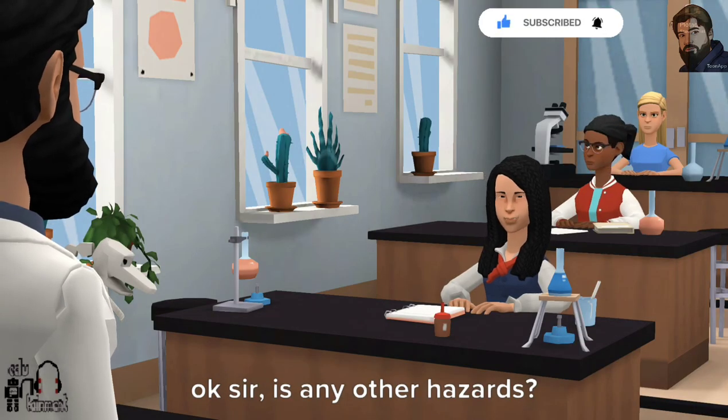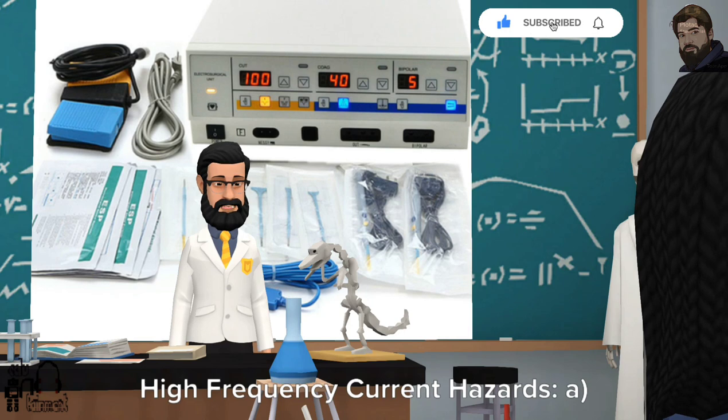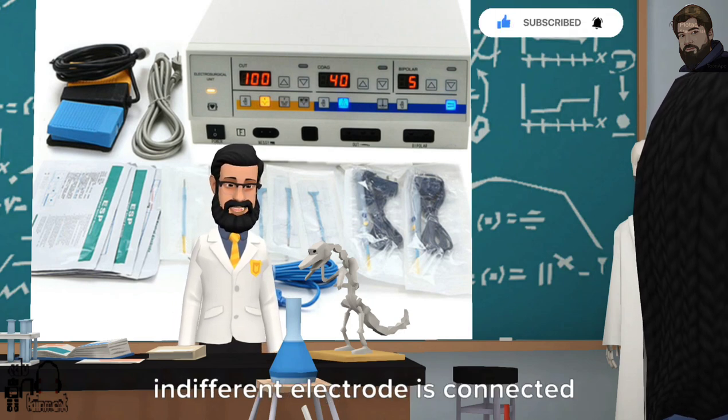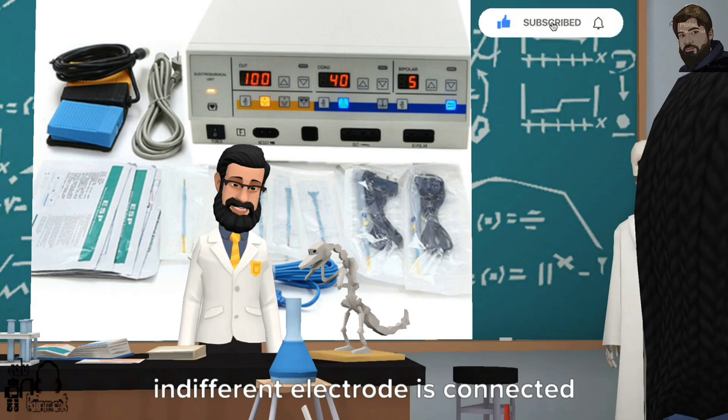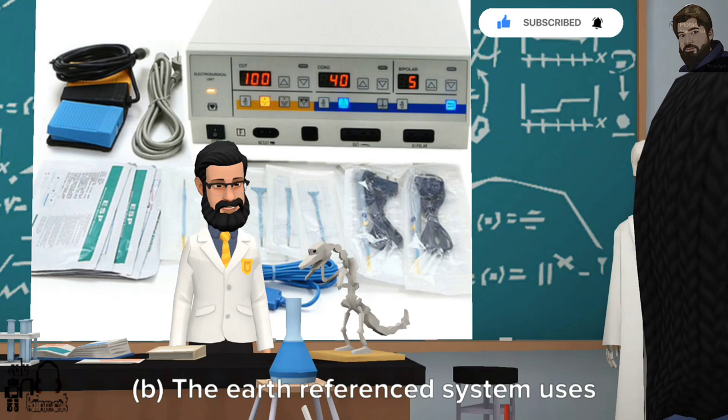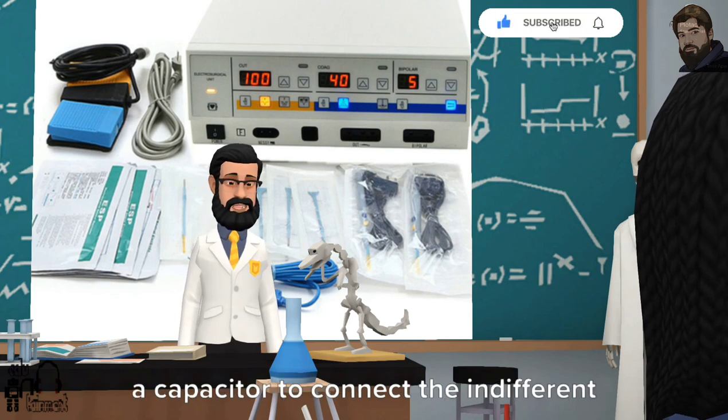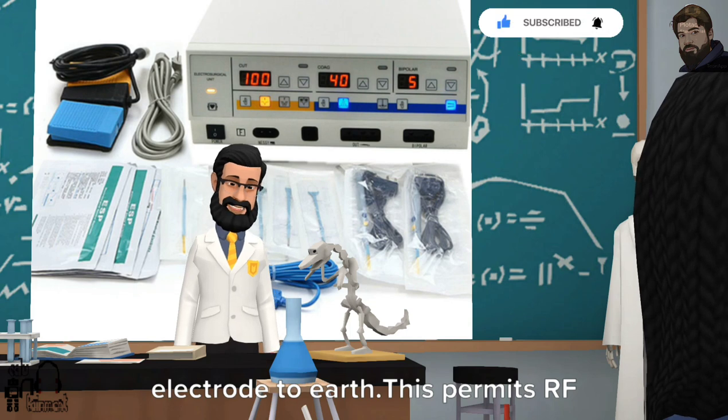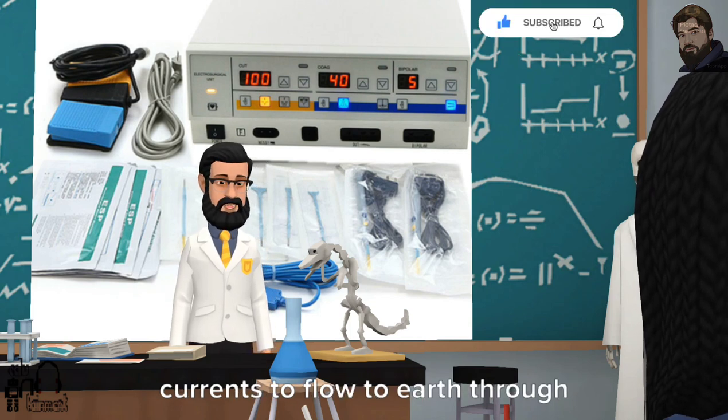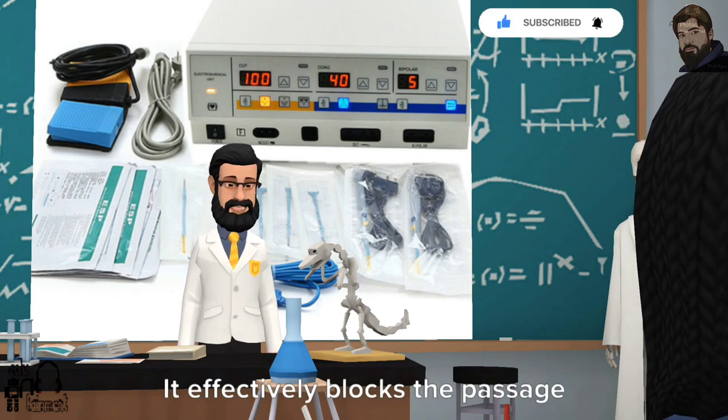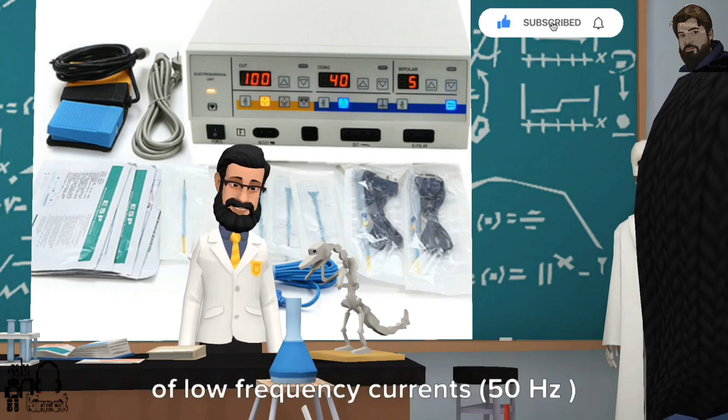Is there any other hazards? High frequency current hazards. In the earthed output system, the indifferent electrode is connected conductively to protective earth. The earth referenced system uses a capacitor to connect the indifferent electrode to earth. This permits RF currents to flow to earth through the diathermy machine. It effectively blocks the passage of low frequency currents (50 Hz).